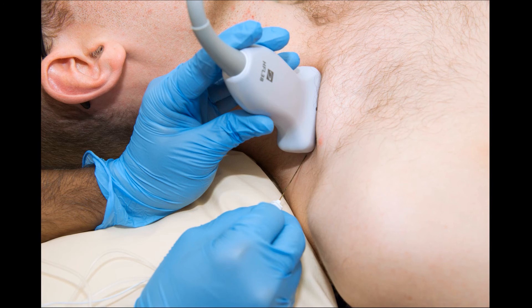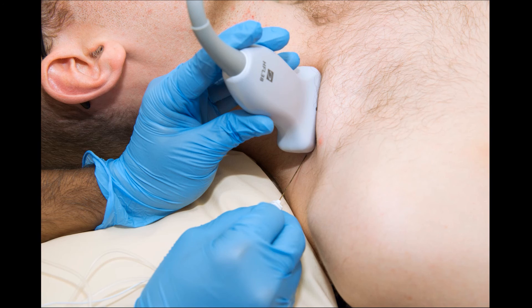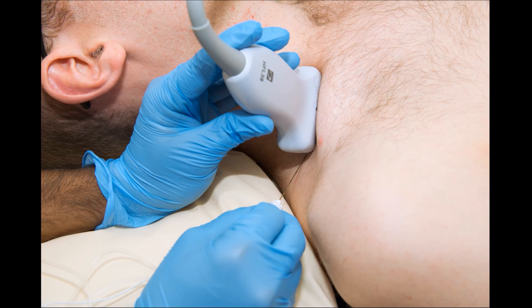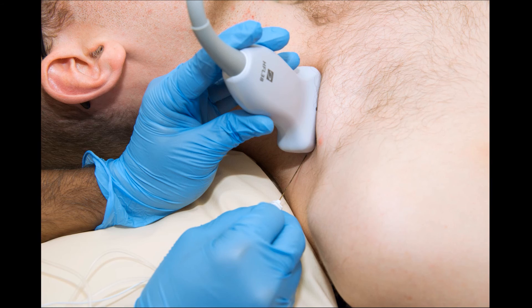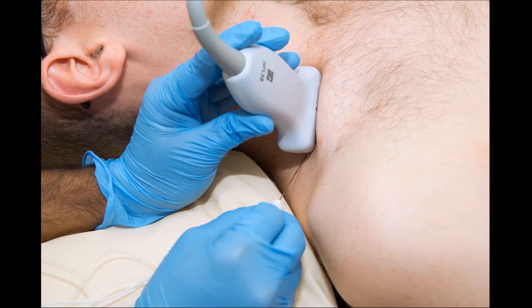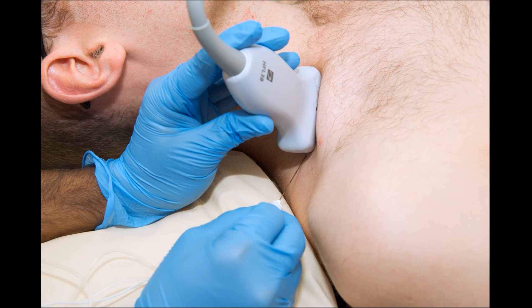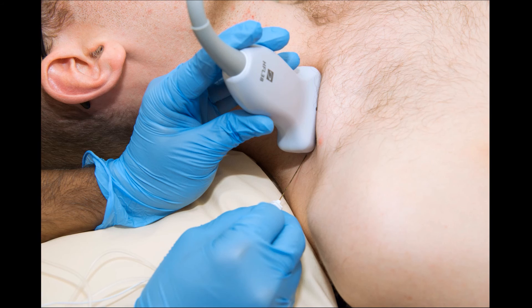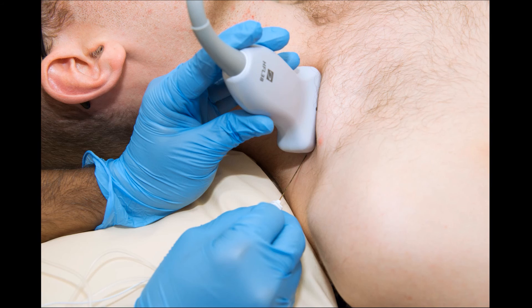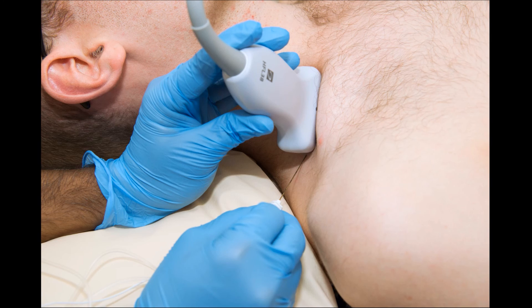The ultrasound-guided anterior approach to the suprascapular nerve block is performed similarly to the supraclavicular block, with the patient supine and head turned to the contralateral side. A 6 to 13 megahertz linear probe and a 50 millimeter Stimuplex insulated needle are used. An in-plane lateral-to-medial approach is used, and typical volumes of 2 to 5 milliliters are sufficient to block the suprascapular nerve at this location.